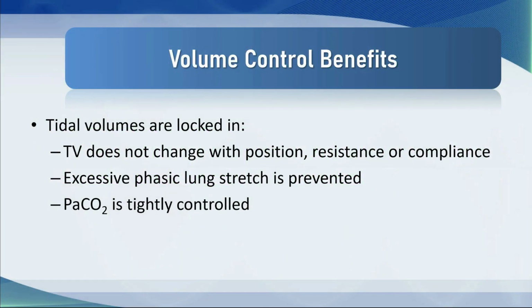For example, volume control is a wonderful mode of ventilation, and many ICUs use either volume assist control or SIMV volume control, and they use it for a really good reason. The tidal volumes are locked in. The tidal volume doesn't change with position, with airway resistance or lung compliance. Excessive phasic lung stretch is prevented, and the PaCO2 is tightly controlled.